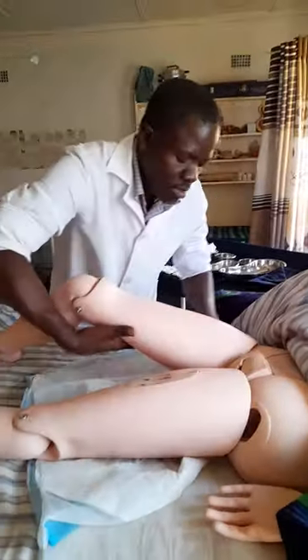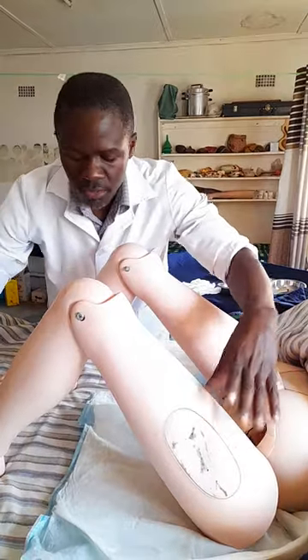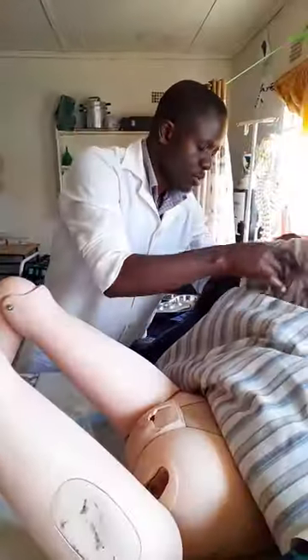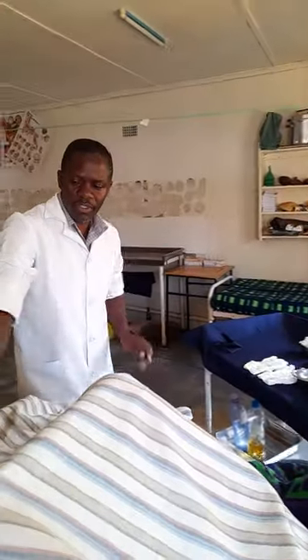If secretions are present you can wear gloves, but if they are not all over just place the sheet. Leave the patient in the dorsal position. Cover the patient — at this point you have prepared the patient so that when you come back you just remove the bed sheet.